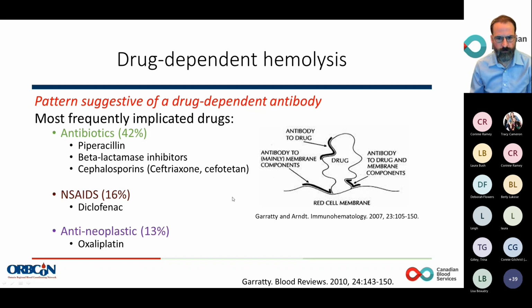And so that's why with the screening cells in these cases, since the screening cells don't have the drug being incubated with them, and they're not going to have the drug bound to their surface, they therefore shouldn't react. Unfortunately, not all these cases read the textbooks, and so you do see occasional cases of drug-dependent hemolysis where the screening cells are positive. So it becomes a little bit harder to be suspicious of a drug-dependent process in those cases. But if we're seeing a screen that's negative with a positive autocontrol, and can confirm there's no transfusion history, then that really becomes the most likely possibility.